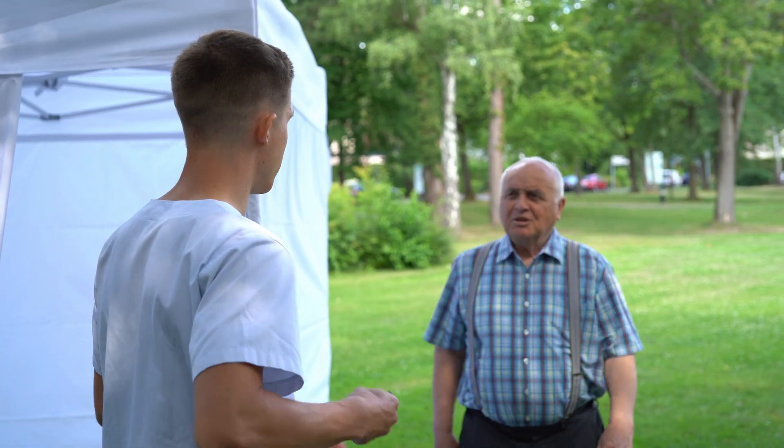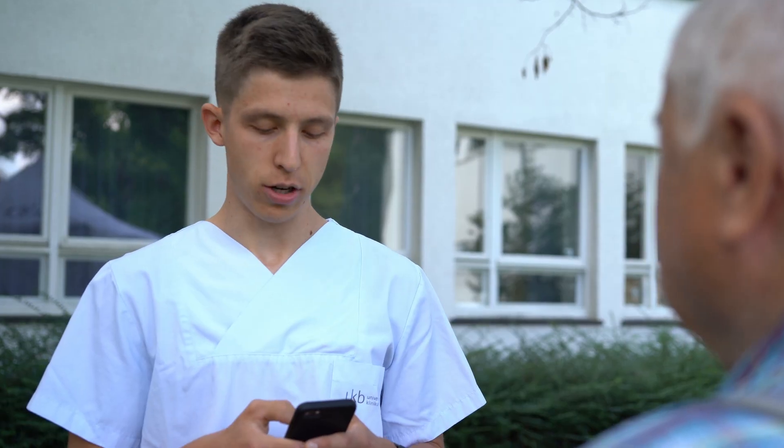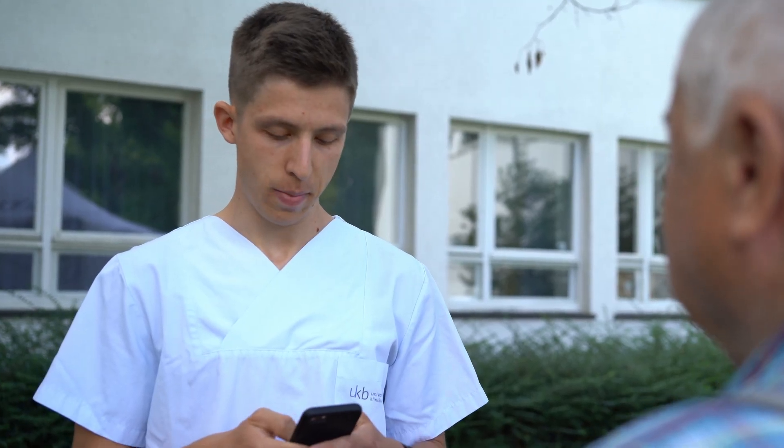Using telemedicine, screening for diabetic retinopathy can become more easily available, and screening coverage as well as cost effectiveness can increase. The core element is the screening camp, where patients are examined not by doctors, but by medical assistants using imaging devices.